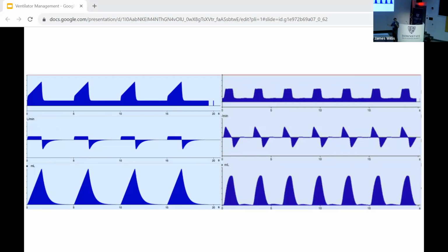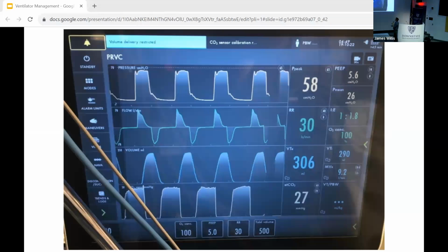When a ventilator looks this pretty, it typically means that the patient is very passive. They're not very interactive. And what I mean by interactive, sometimes they get agitated and very interactive. They're very uncomfortable. The waveforms will look almost like an EEG or an EKG. So the point is we're starting with patients that are very passive. They're comfortable. This is the immediate post-intubation when they're under the influence of rocuronium, hopefully with some sedation. PRVC. So what's the difference between PRVC and VCAC and PCAC?